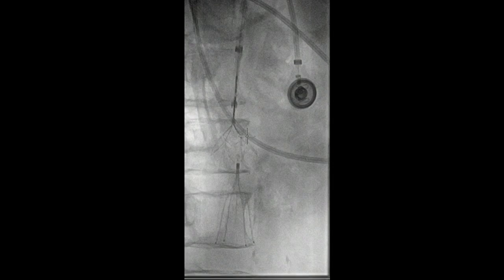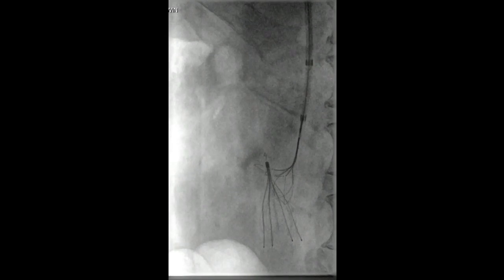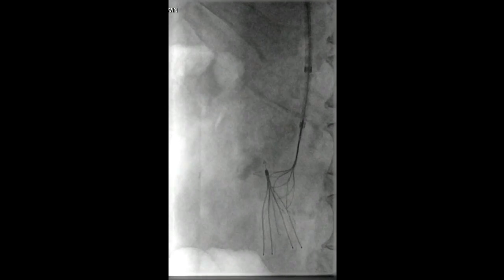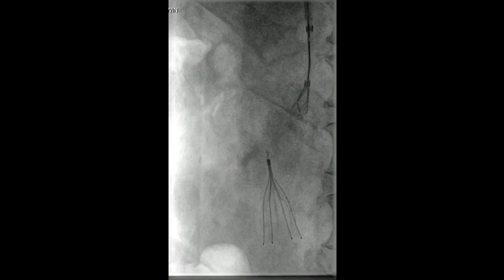For this reason, I usually get a CAT scan on all these patients to get some idea of the complexity, because on an AP view it can look central, but on a more oblique view you can see the filter is clearly tilted. Still not touching it despite multiple attempts.